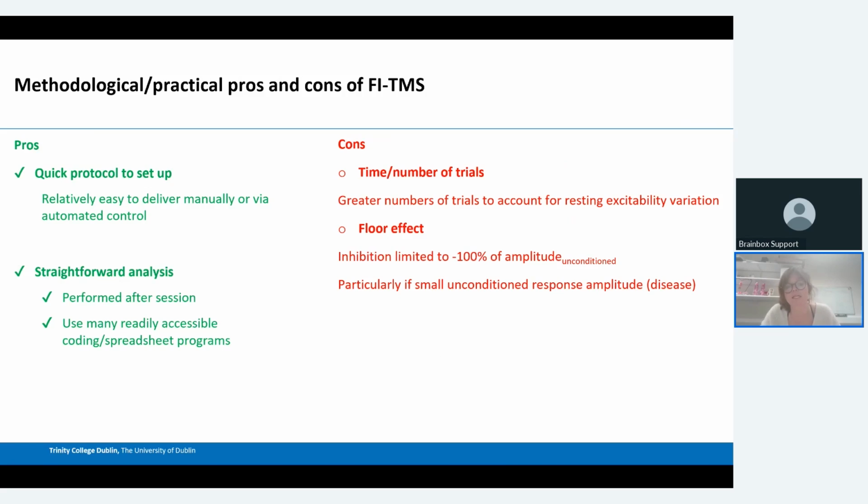And this is particularly a problem if you're dealing with small muscle responses to your test stimulus in the first place, which could happen in diseases like motor neuron disease.